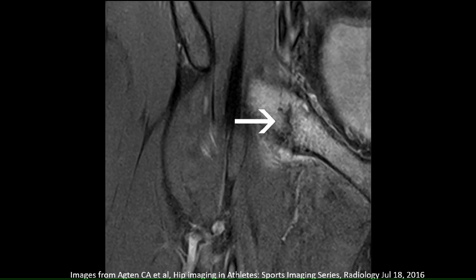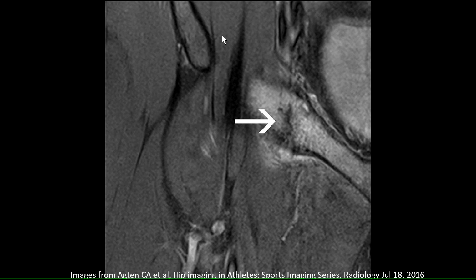Stress fractures are always a very good differential diagnosis in athletes with bone changes. Here is a nice example of a vertical stress fracture in the anterior column of the acetabulum. If stress fractures occur in the acetabular roof they are more horizontally aligned. You can also have stress fractures in the femoral bone. Keep in mind that after arthroscopic osteochondroplasty for cam deformity, about 2% of patients can get an insufficiency fracture of the femoral neck because too much bone was removed.